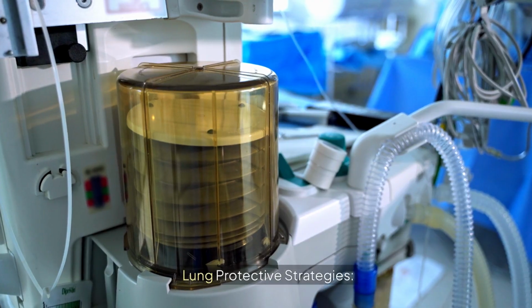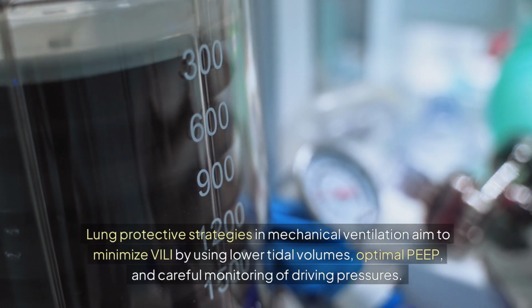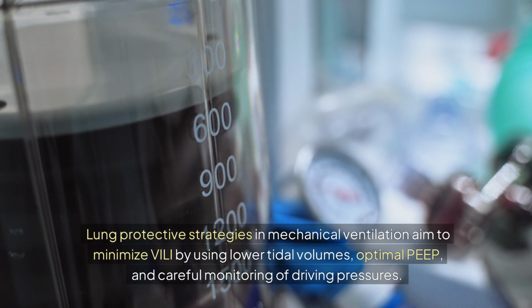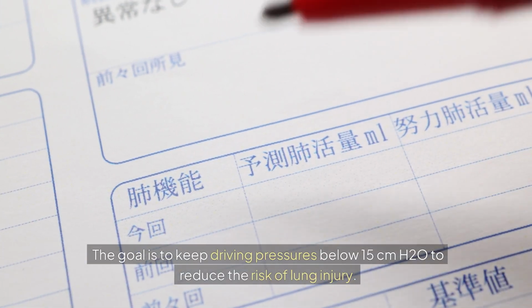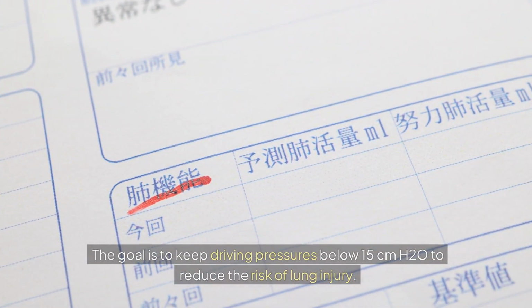Lung protective strategies. Lung protective strategies in mechanical ventilation aim to minimize VILI by using lower tidal volumes, optimal PEEP, and careful monitoring of driving pressures. The goal is to keep driving pressures below 15 cm H2O to reduce the risk of lung injury.